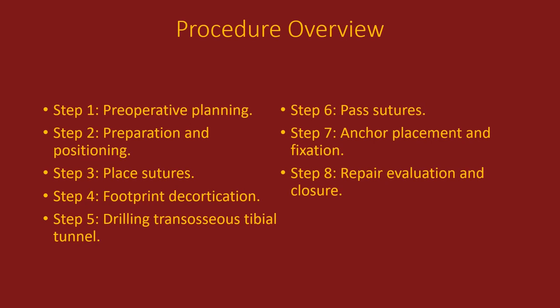Transosseous repair of a medial meniscus posterior root tear involves native root footprint preparation, placing and passing sutures through a drilled transosseous tibial tunnel, and definitive fixation. This video will provide an overview of the key steps in this procedure.